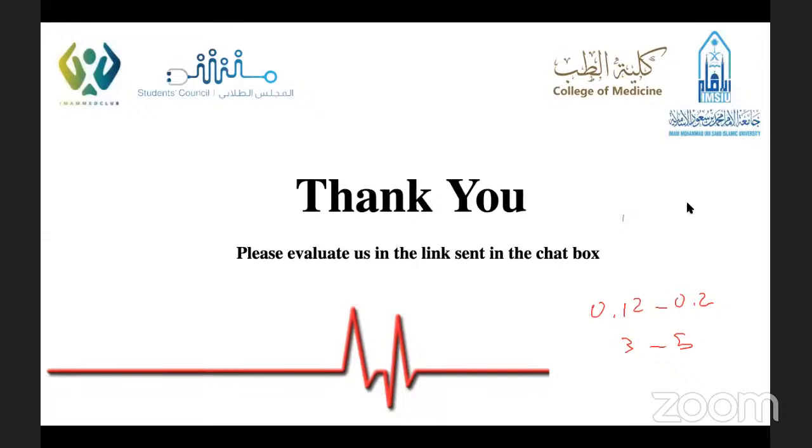يعني إذا كانت أكثر من 5 small squares في عندنا مشكلة، أو إذا أقل في مشكلة.